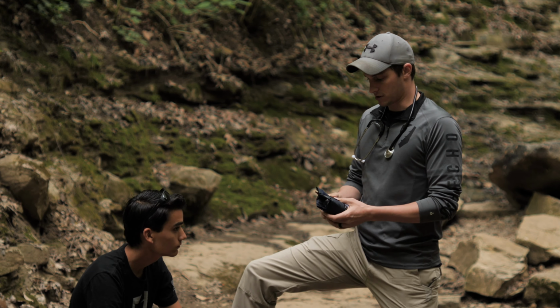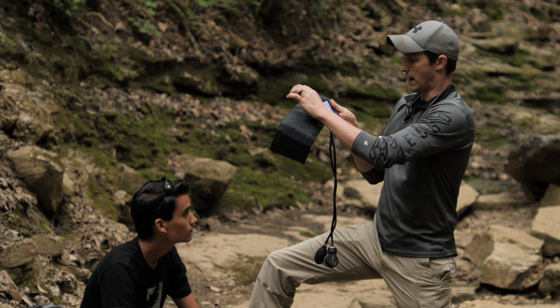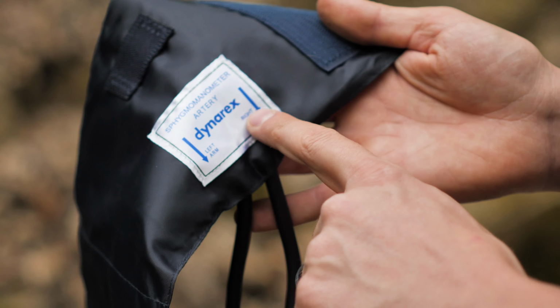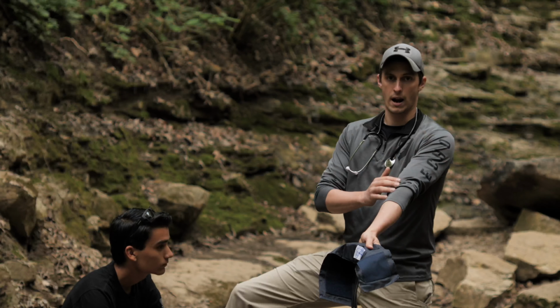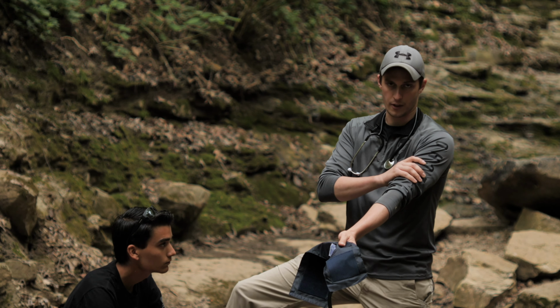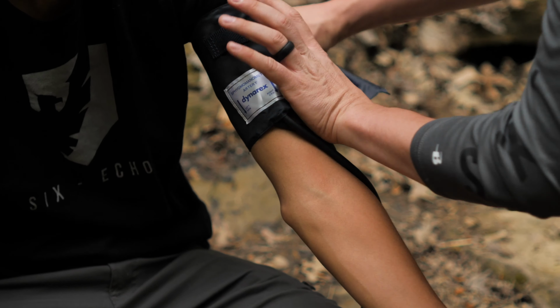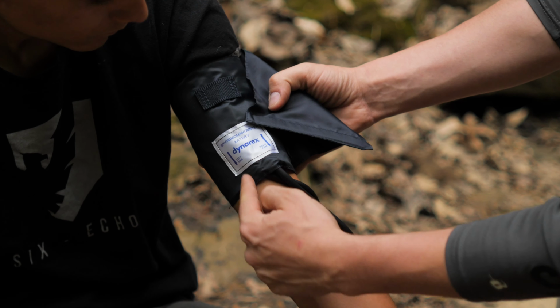So first off, I've got my blood pressure cuff here. Notice we have some artery markings. We're going to use those artery markings, and we're going to make sure that that's in line with the artery. The artery that we're going to be listening to is the brachial artery right here on the arm. So we're going to slide it on the arm and line those up. I'll go ahead and slide this on. I'm going to go up above the joint, leave a little bit of a gap there. That way we have some room to put our stethoscope.